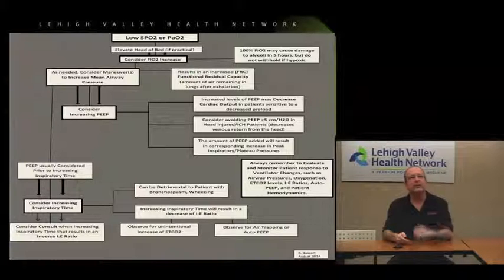On the other hand, there are times we do need to make changes. Sometimes their settings aren't the most appropriate when we pick them up at referring hospitals. Sometimes there's been changes in that patient since the time they called for us, or even since the time we initially put them on the ventilator, whether it was from a scene flight or maybe in a facility that we actually started on our ventilator because they were using a bag valve when we got there.